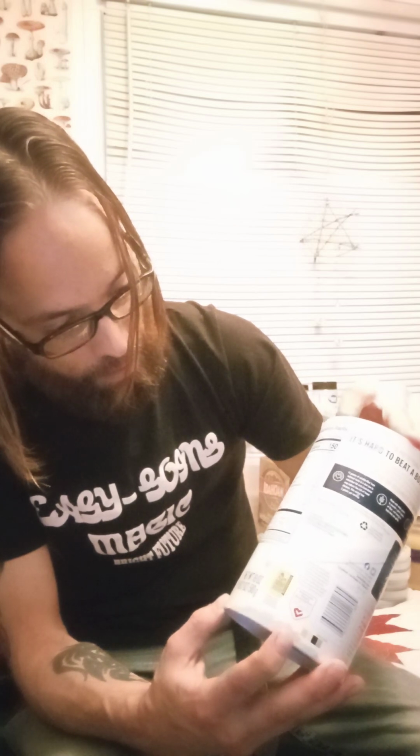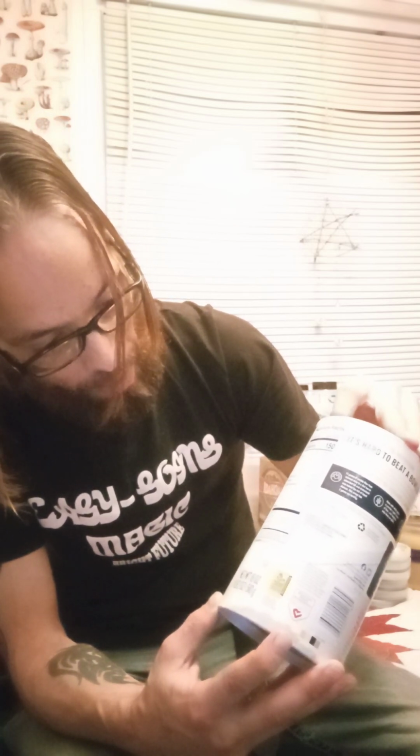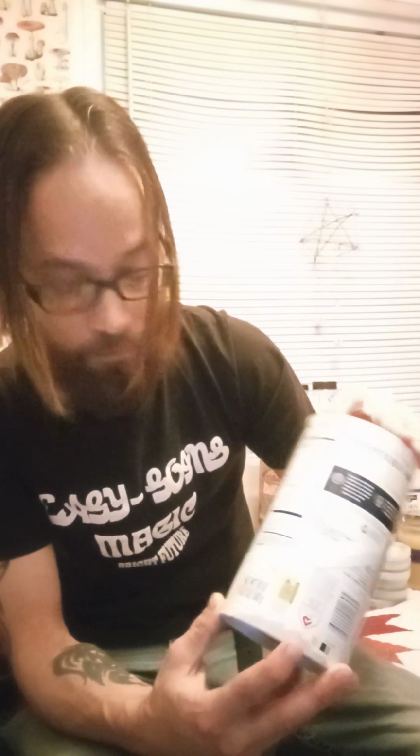And then you go down and you look at iron, potassium, thiamine, magnesium. There's 40 milligrams of magnesium. Double that, 80 milligrams of magnesium. Think about pouring agar plates that need magnesium to set. Yes, you would have to play around with the formula a little bit, but what if you could get the majority of the magnesium you need to set them plates from something as simple as a cheap thing of oats?